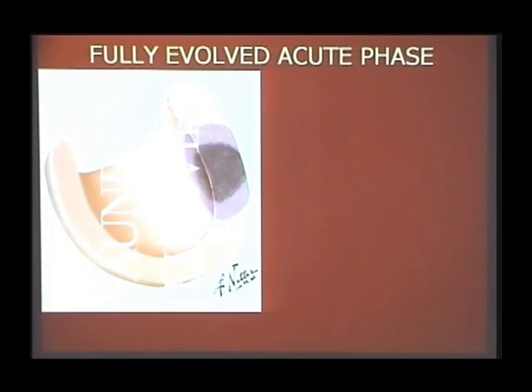The patient may after thrombolytic therapy will have a Q wave V1 to V3. V4, V5, V6 you may be able to save. At the most of the time you will be able to limit the infarct size rather than prevent an infarction. So that's what usually happens. So what happens is the thrombolytic therapy, after thrombolytic therapy, or the patient has not come for the early stage, everything is injury in hyperacute phase. The central area of this injury undergoes an infarct change. The central area dies. So it becomes a necrosis.